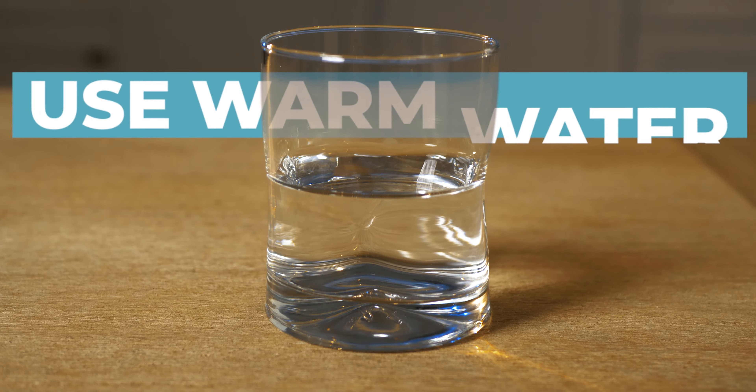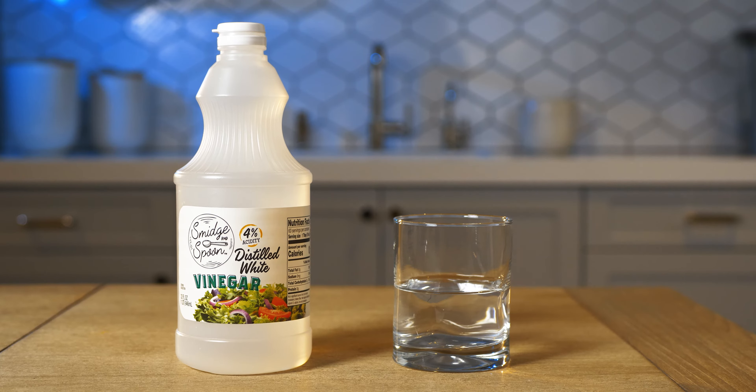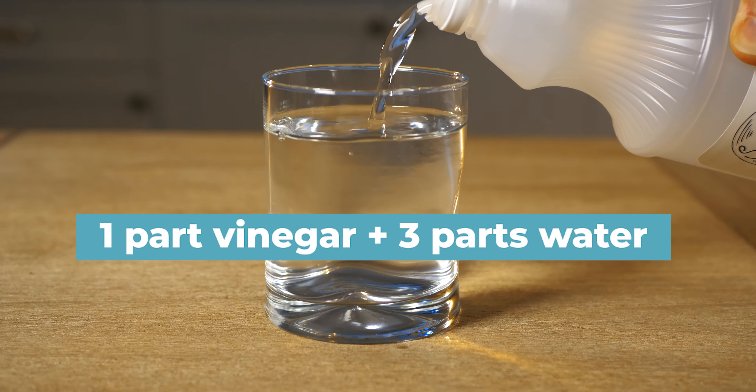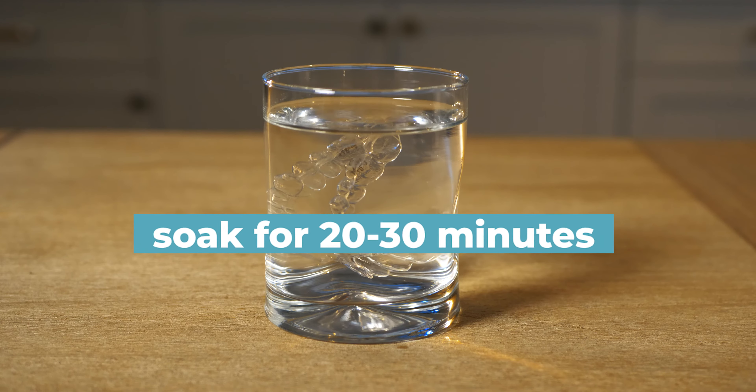Use warm water for all three of these methods. The first method is vinegar and water. Mix one part vinegar to three parts warm water, and soak for 20 to 30 minutes.